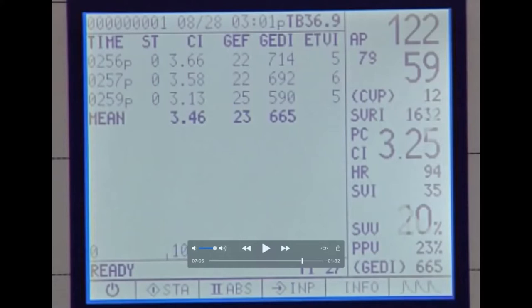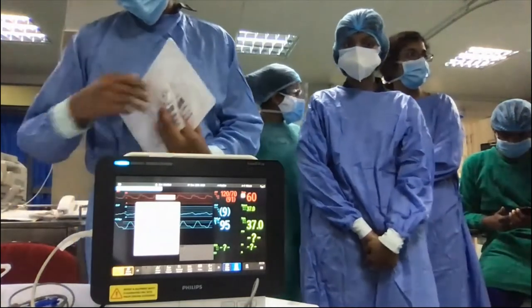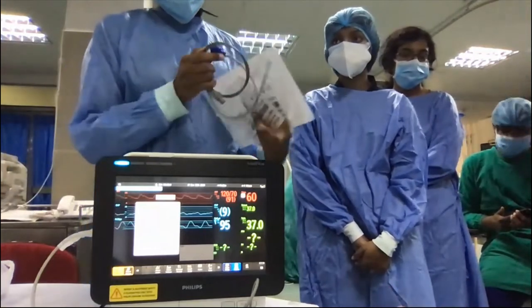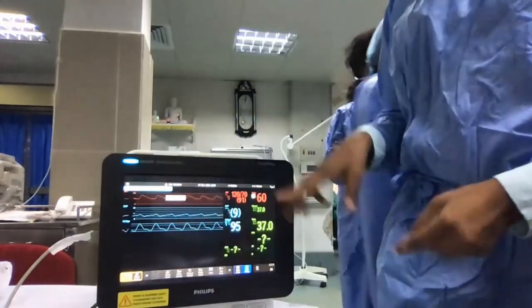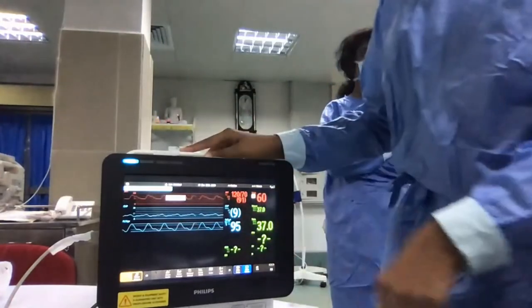So now we'll move on to our monitor, and Vindhya will show us the monitor that is available for us in the ICU, how to set it up and how to get the calibrations going. Okay, right. So this is basically the setup, the PiCCO monitor. I didn't switch on and do all these processes. I will just go to how to calibrate PiCCO.